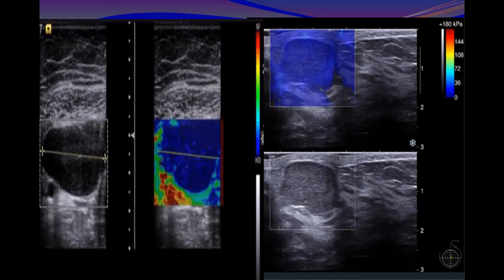This is strain. Excellent. Well done. Why is this strain? The hard is blue, and always with shear waves the hard is red. Because in the map, the hard is blue. Yeah, here the hard is blue. That means it is strain. Okay, yes. Excellent.